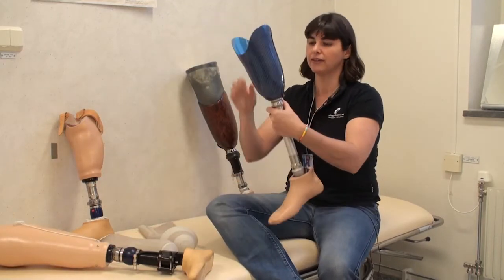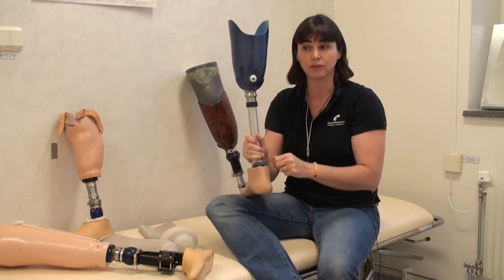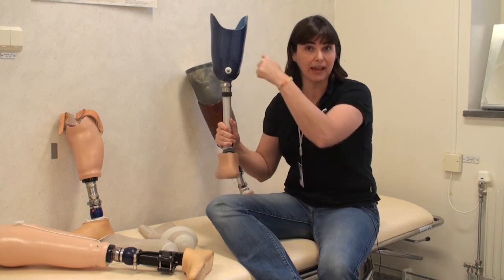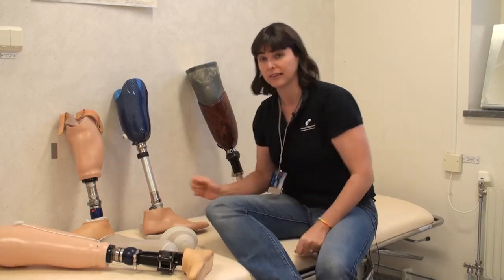In some cases, we could have a vacuum seal, so we have a one-way valve where air can pass out of the prosthesis but not into the prosthesis. And when the patient takes it off, they press a button to let air into the prosthesis so they can pull the stump and the sleeve out.